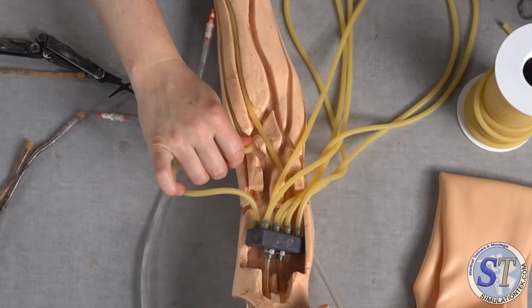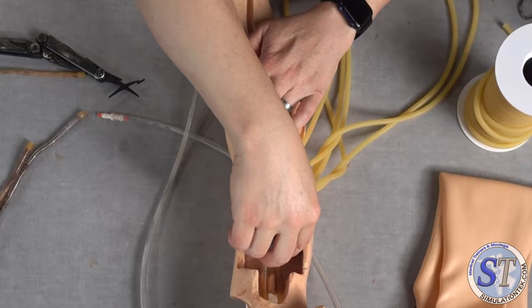This extra tubing here, it's a good thing. I'm gonna leave that long. Now, when you're getting ready to put the skin in, you don't want anything extra, you wanna cut those down. But this is just for placement and making sure I'm good.